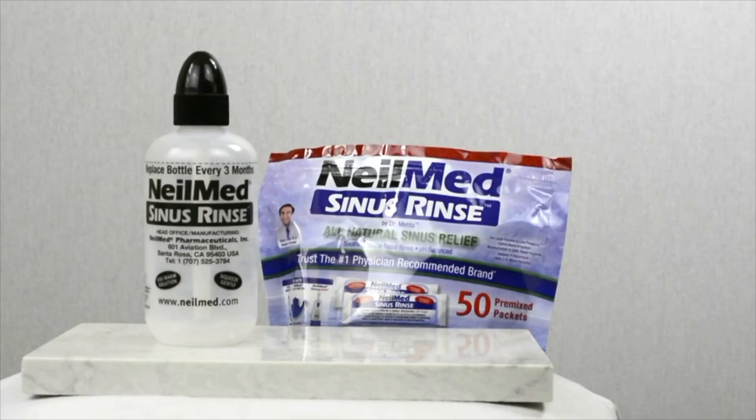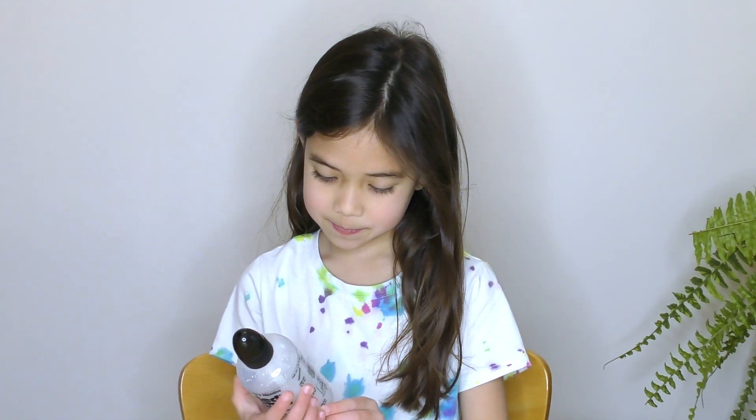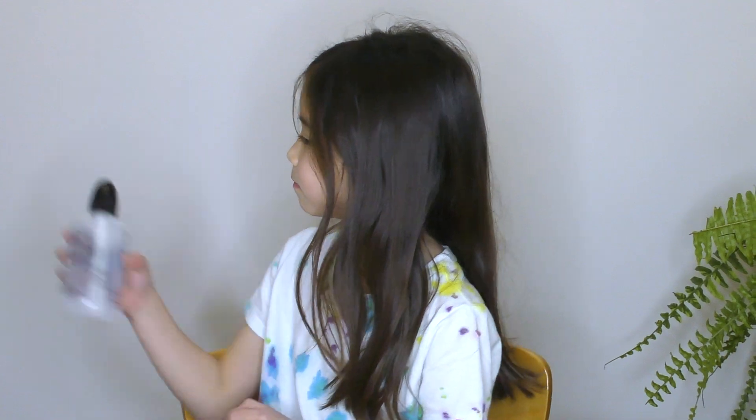There are many different devices available to rinse the nose, but they all work the same way. Here we will demonstrate using a NeilMed bottle.